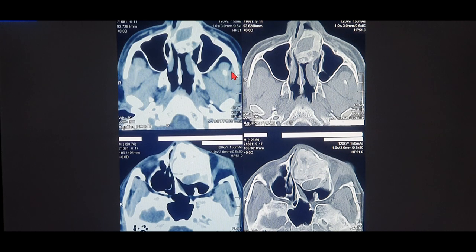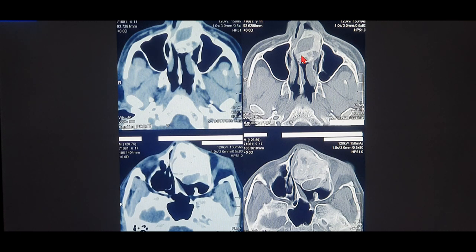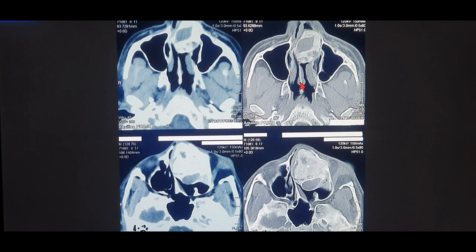The first point: what is the difference you can see between the two scans? The soft tissue window is kind of bright - it is illuminating. The bone in that scan is bright white and illuminating a lot. If you see the same view in a bony window, the bone is not as bright, not illuminating, and the scan is kind of dark gray. So the first thing to look for is brightness - if it's illuminating, it's a soft tissue window; if it's darker, it's a bony window.